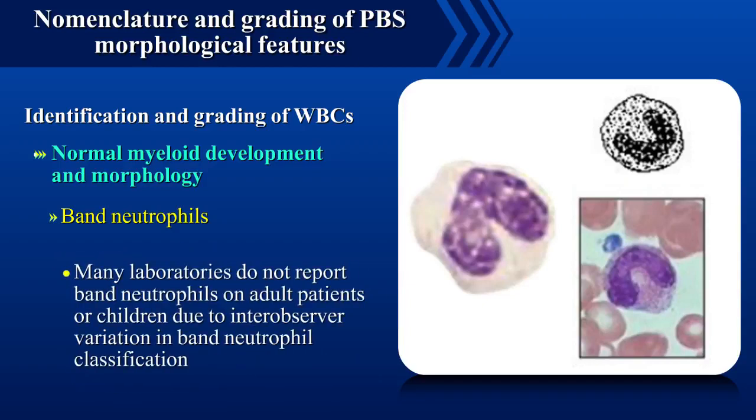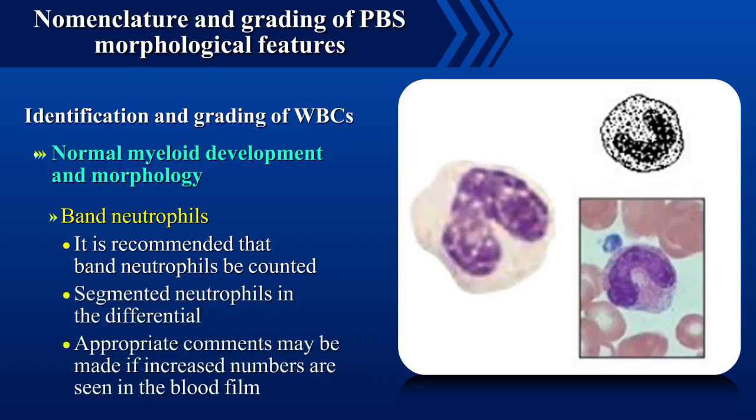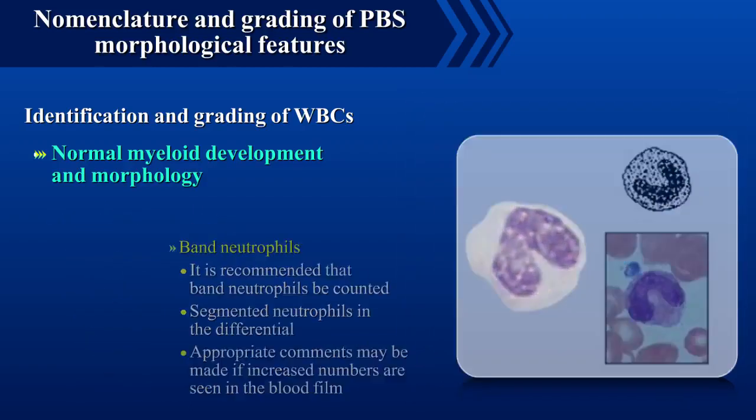Many laboratories do not report band neutrophils on adult patients or children due to inter-observer variation in band neutrophil classification. It is recommended that band neutrophils be counted as segmented neutrophils in the differential. Appropriate comments may be made if increased numbers are seen in the blood film.